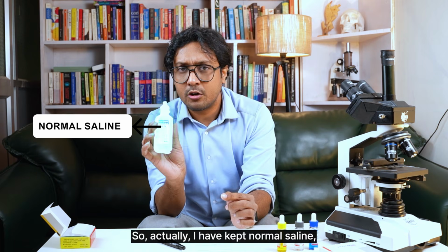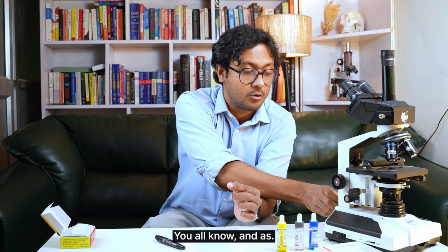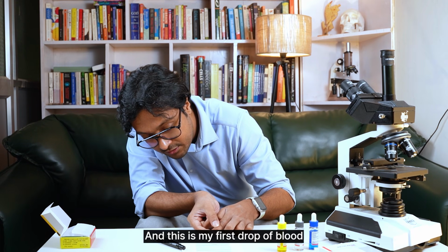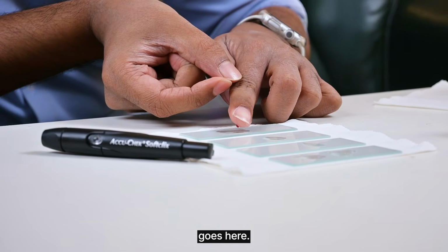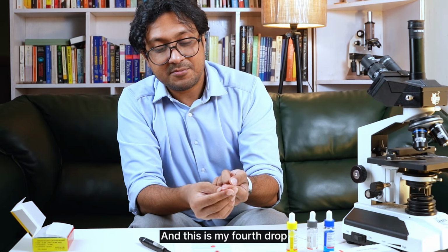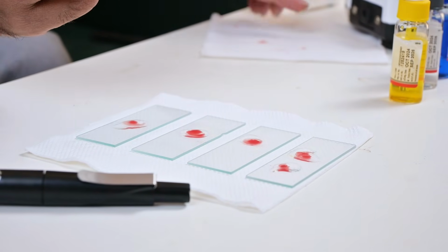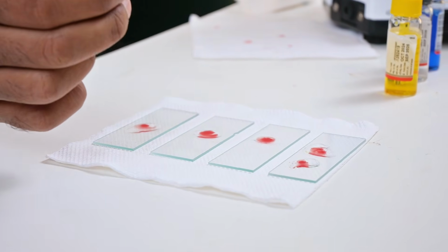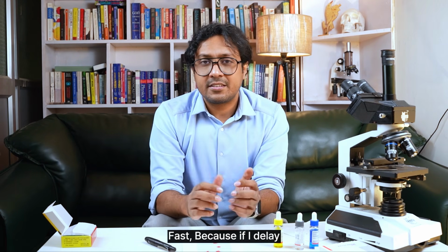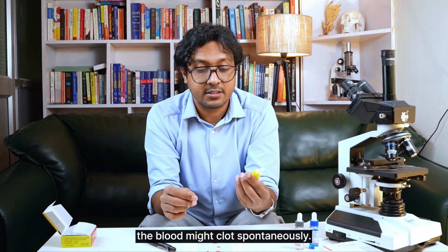So actually I have kept normal saline, which is 0.9% sodium chloride, you all know, NS. And this is my first drop of blood. It goes here. And this is my fourth drop. It was really tough. Okay. Now I'll explain why I have taken the fourth drop. But first, let's do the experiment, because if I delay, the blood might clot spontaneously.